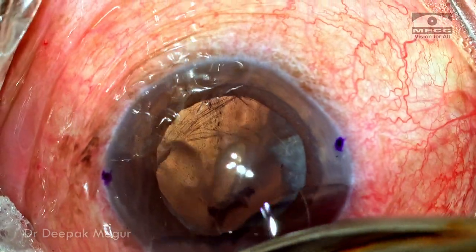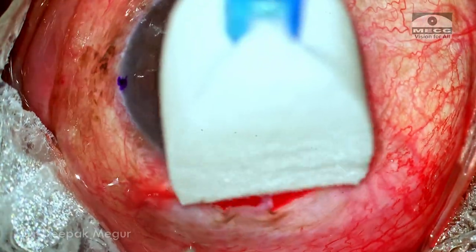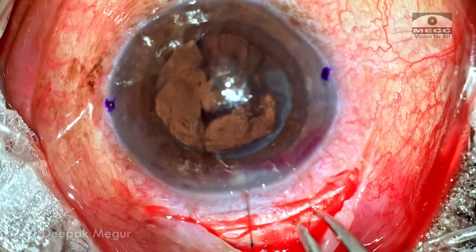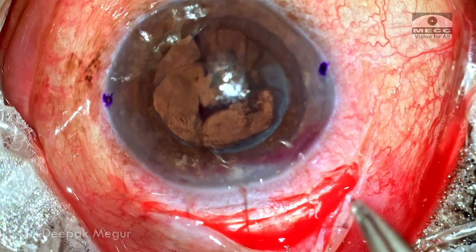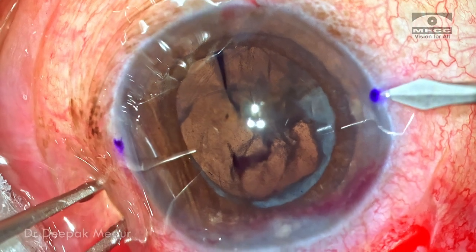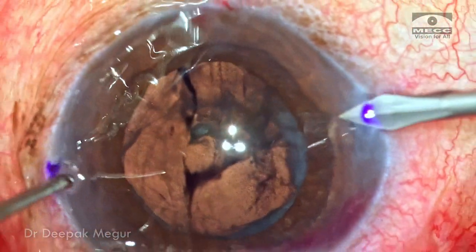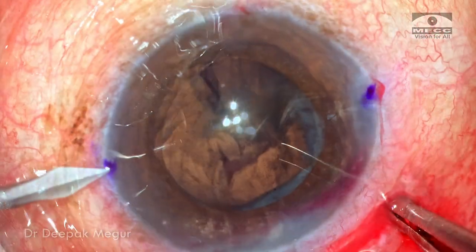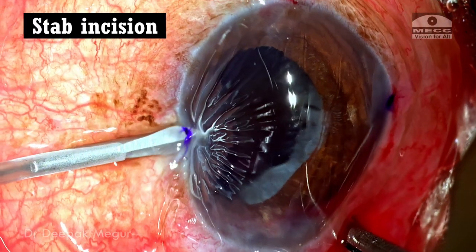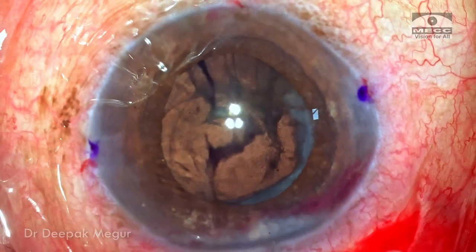I'm retracting the conjunctival flap and examining the wound area. We can see the scleral tunnel incision which has been sutured with three sutures. Now I'm performing the side ports at the marks I've created. The side ports are fashioned as stab incisions, which are of great help when tucking the iris clip lens.